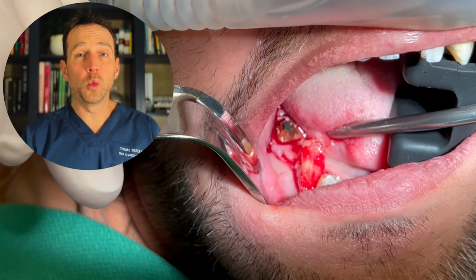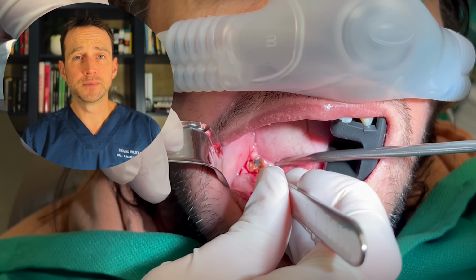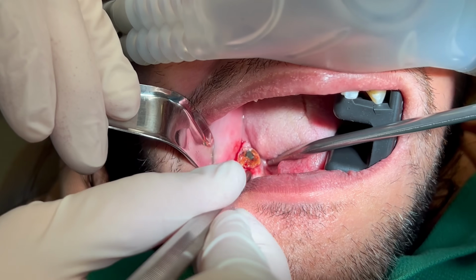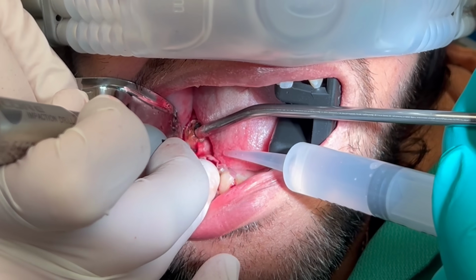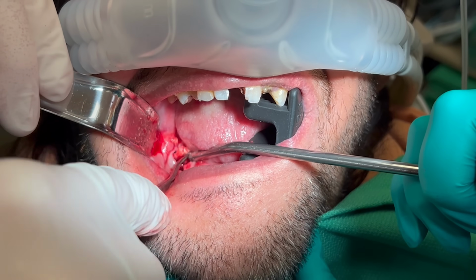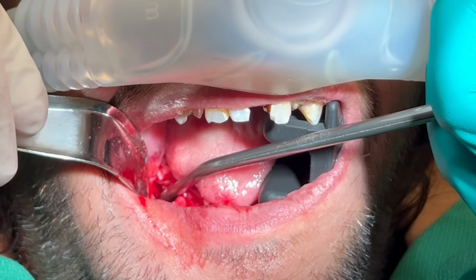Tooth number 28 came out in one piece, but the caries on tooth number 31 went very deep, and the tooth came out in multiple pieces. I was hoping I would be able to drain purulence through the extraction socket, but there is nothing coming out. So now I need to make a vestibular incision to drain this infection.